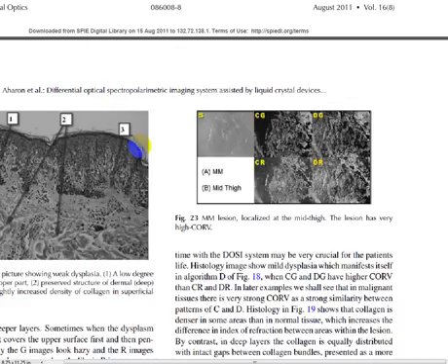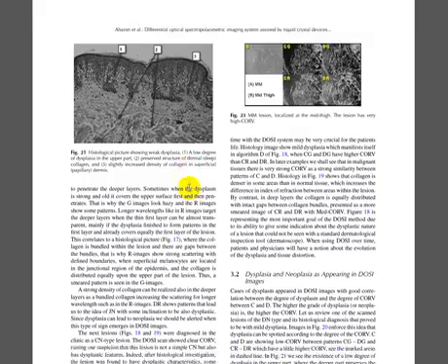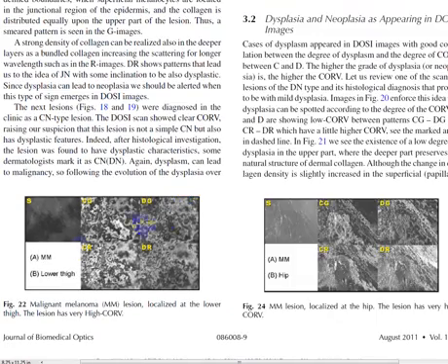But checking several cases, we could realize that, for example, this is also another lesion with malignant melanoma, and this is another one. You can see very decisively that the inner part is first totally different from the algorithm and the picture itself when I see it without the machine. So dosi can produce wonderful pictures to follow up a lesion.